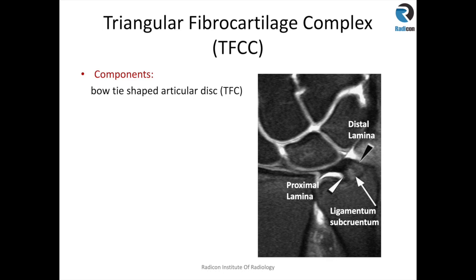It's a normal signal change in that region which is seen in almost all cases. On the radial side, the TFC disc attaches onto the hyaline cartilage, so this intermediate signal between the cortex of the radius and the radial side of the TFC disc is just cartilage and it's not a tear — that's also a normal appearance.